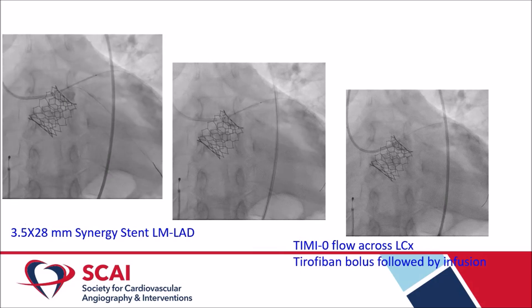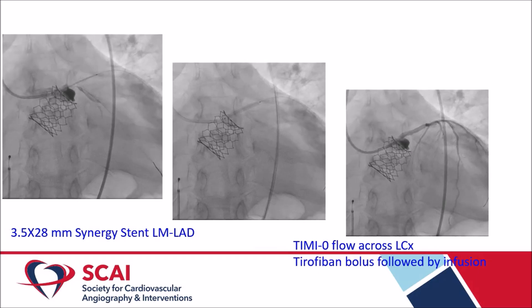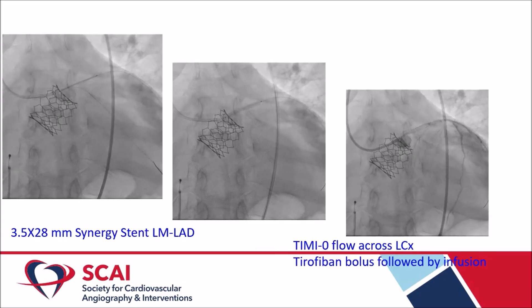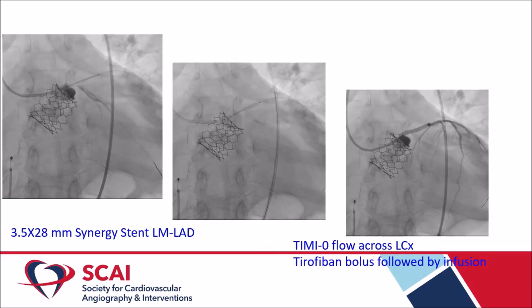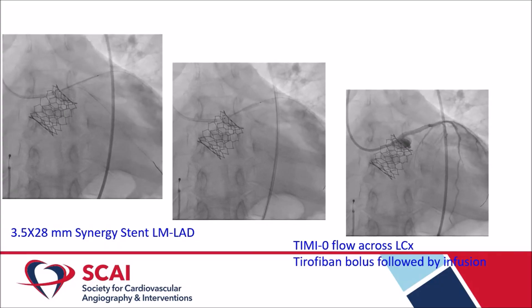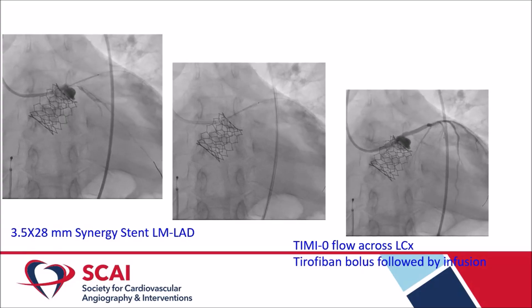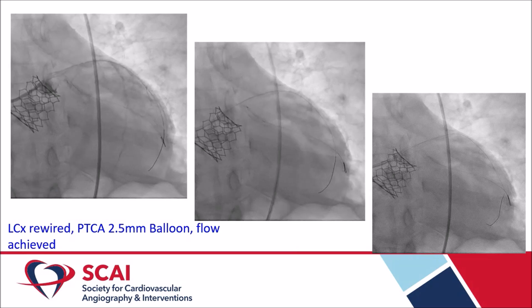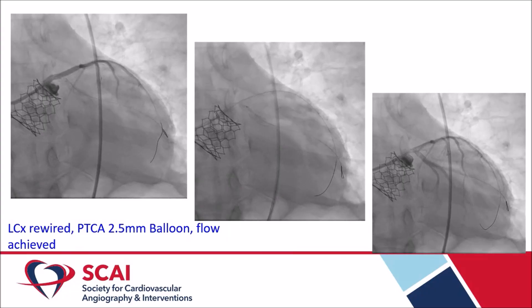A 2.5 mm balloon dilation was performed, followed by stenting with a 3.5×20 mm Synergy stent across the LCX ostium. However, there was again no flow across the LCX and no flow across the left system. A 3.5×28 mm Synergy stent was deployed as a chimney stent from the TAVI valve to the LAD. Flow across the LCX was still absent.